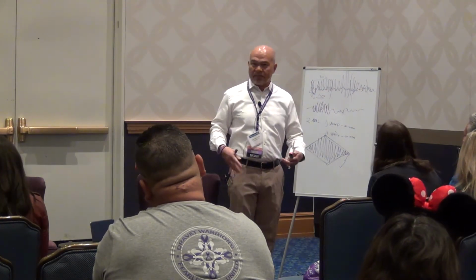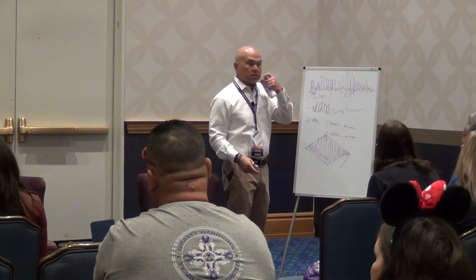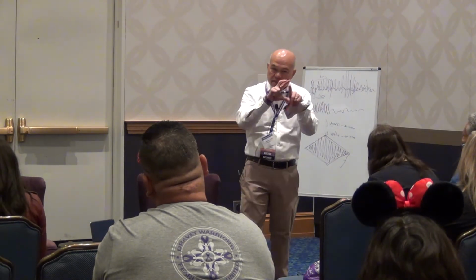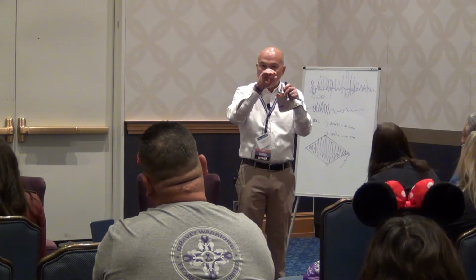Subclinical seizure basically says that you're having seizures on EEG and no manifestation clinically, right? It looks like this. So a bunch of spikes could be subclinical seizures depending on the frequency? You have to have a pattern, yes. There is a pattern that you see in an ictal discharge on EEG that tells you that's a seizure.